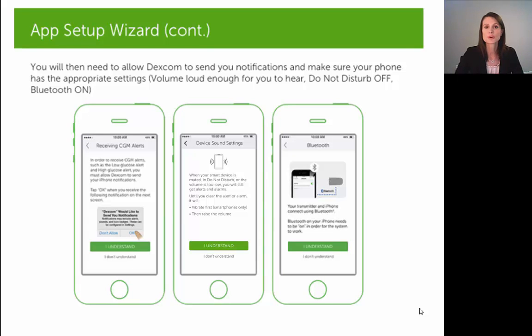The next screen will explain that you need to give the app permission to send you notifications. If you want the app to be able to alert you for a high and a low glucose, you do need to give it permission to do so. When you get that prompt, go ahead and say okay.